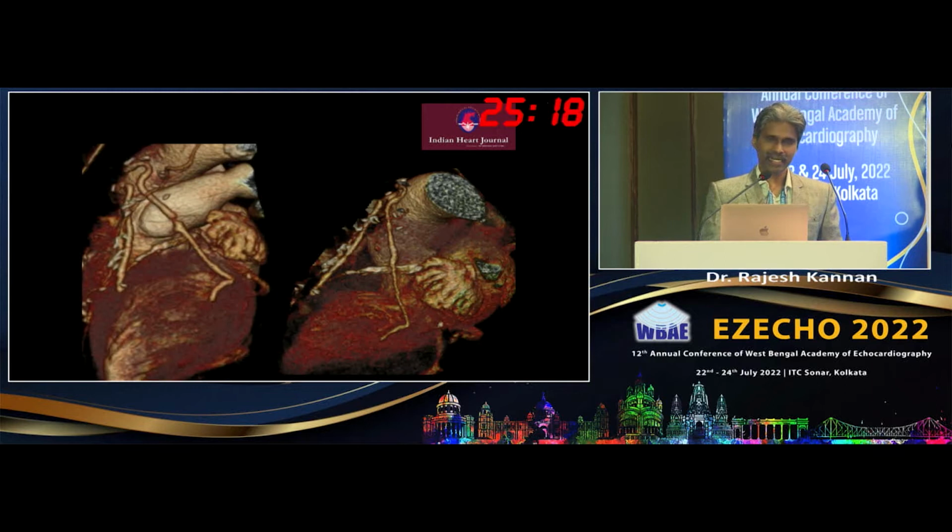But to assess the native vessels post-CABG may sometimes be tricky, especially if there is severe coronary calcification.